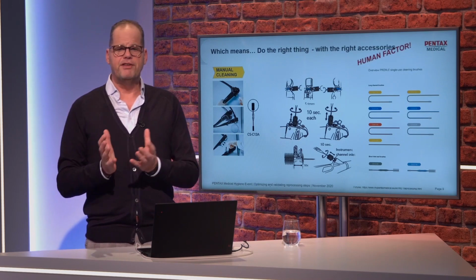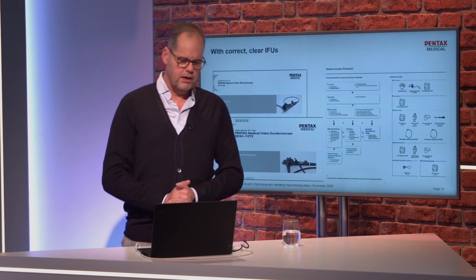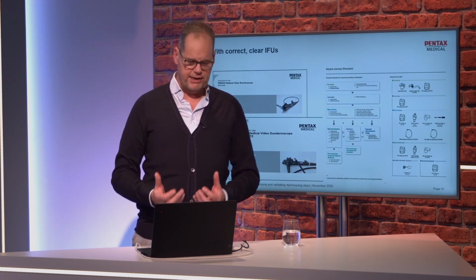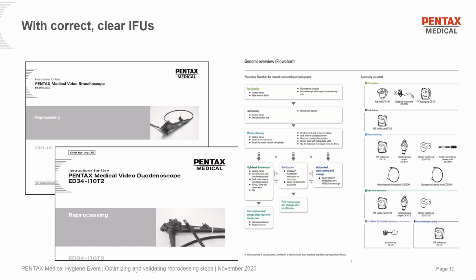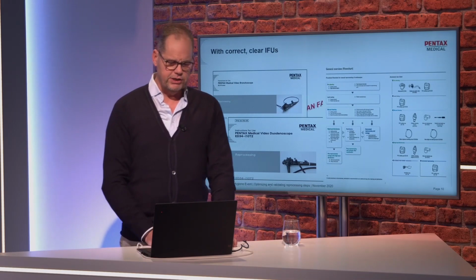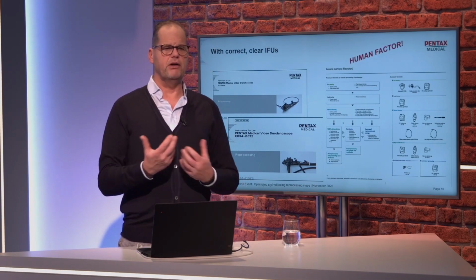But we still have the human factor. As said, we have to do it with the right and correct and clear IFUs. We also heard IFUs are not easy to read. Yes, they are not easy to read. But we, as Pentax Medical, are improving to make these IFUs better and better readable for all those people in the reprocessing, with nice illustrations and step-by-step what you are going to do. But again, we are depending on the human factor.